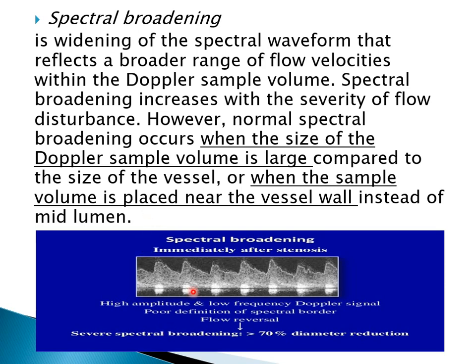For those who have little experience with Doppler, first of all you have to know the difference between color Doppler, spectral Doppler, and power Doppler. The color Doppler is this red and blue display. It depends on the direction of blood flow. If it is toward the probe, usually it is red. Away from the probe, it is blue. You can change it as you like.